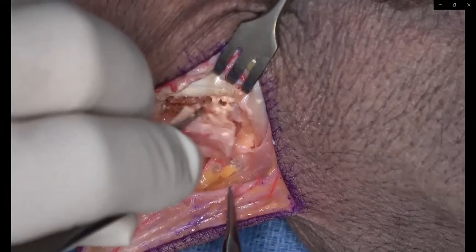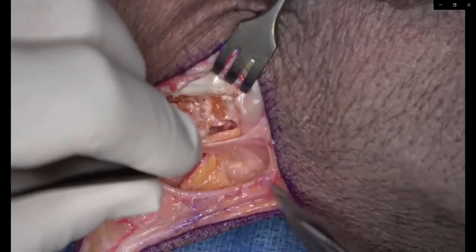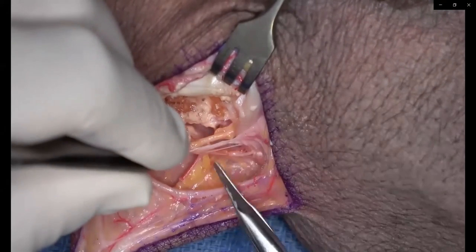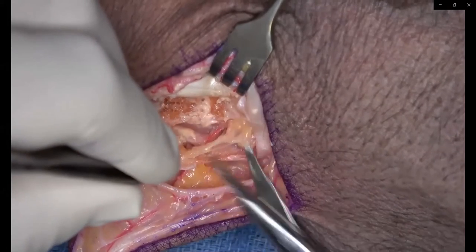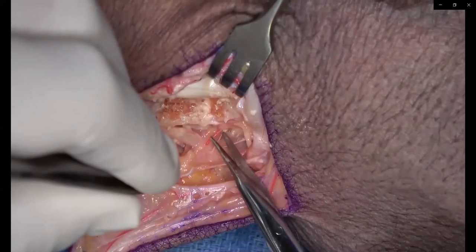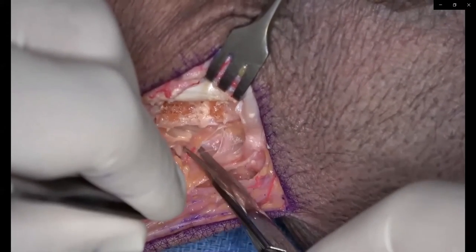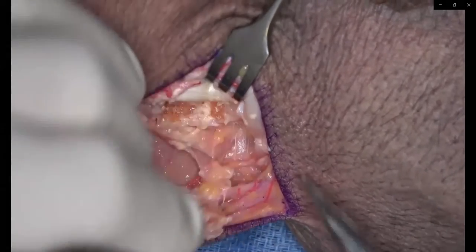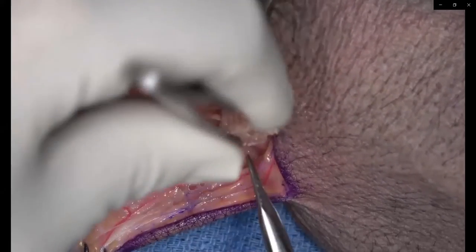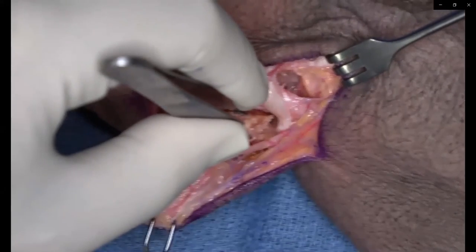Leave a generous cuff of soft tissue around the pedicle. Do not succumb to the temptation to visualize these vessels all the way down to their takeoff from the radial artery because you can injure them and denude the pedicle of venous drainage. Leave a good cuff circumferentially and just trace the whole thing down to its branch point from the radial artery.